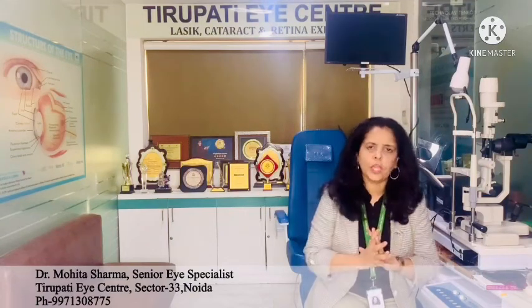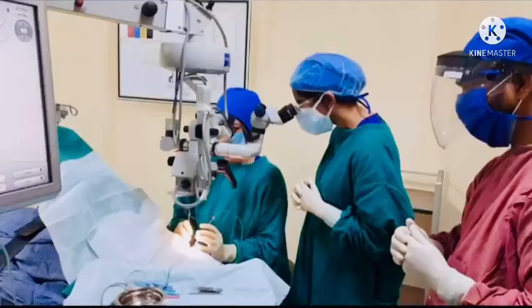The first thing is that even before we start, we should know our machine. Whichever phacoemulsification machine we are using, we should understand each feature of the machine. There may be venturi machines, there may be peristaltic machines, or there may be machines which are actually venturi, but you can control the speed at which the surgery is happening. So you can start with a slower speed which mimics a peristaltic mode, and then go on to a moderate speed and then to a faster speed.